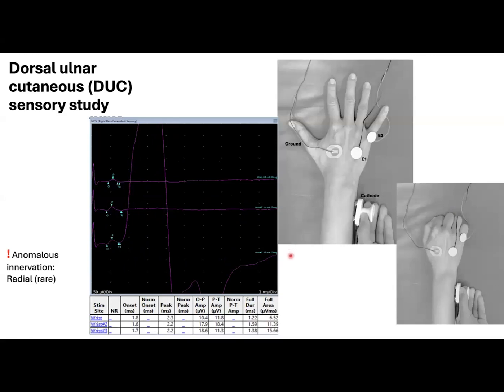Here we have an antidromic dorsal ulnar cutaneous sensory study with the recording electrode placed over the web space between the little and the ring fingers, and the reference placed over the metacarpophalangeal joint. Others may prefer to place both electrodes more distally, but the potentials are very similar with either recording technique. Also, I wanted to show you an alternative hand position that I think can improve stillness while avoiding displacement of the electrodes.